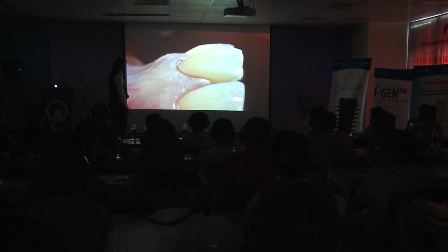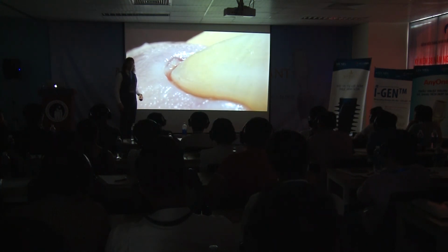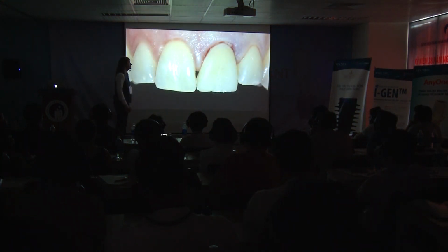But my problem is that I didn't see this. The bone is not inside, it is outside. I left a way to come out. It seems very little, but it can do disasters.